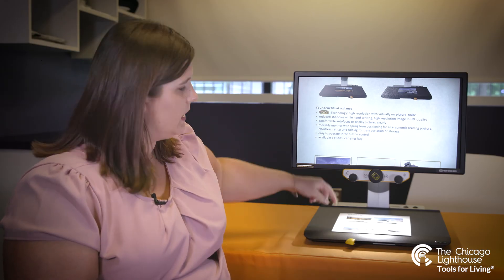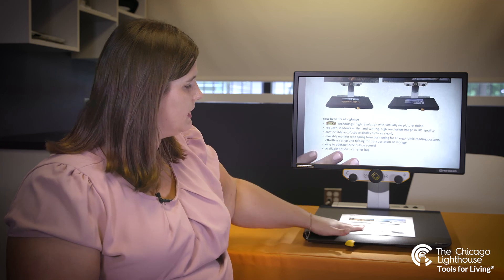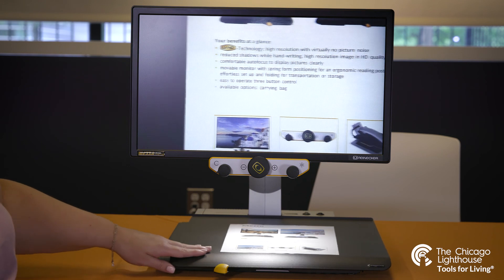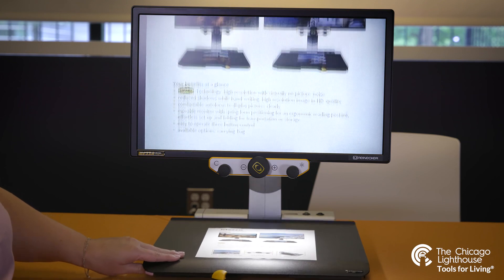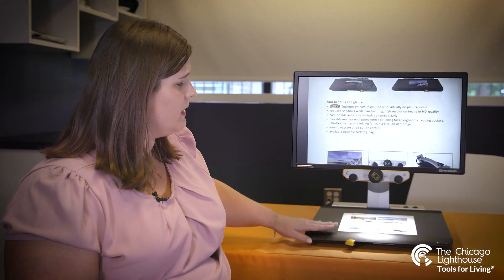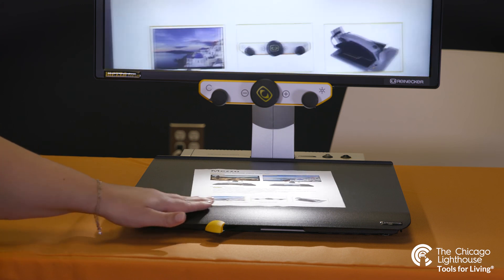Our camera is located behind our monitor here. It is shooting straight down onto our XY tray. The XY tray is designed for simplicity — place our materials under it and once we have our materials set, the XY tray will allow us seamless transitions moving our materials left and right or up and down on the screen. This is an advantage over having to physically move the paper, as we tend to move paper in different directions which can cause slanted images.